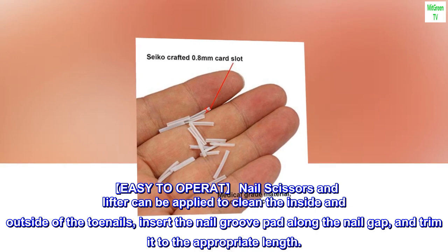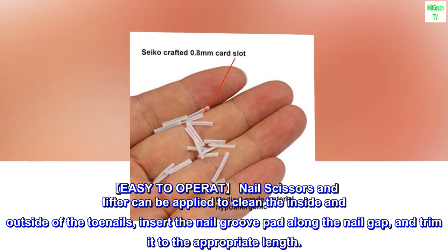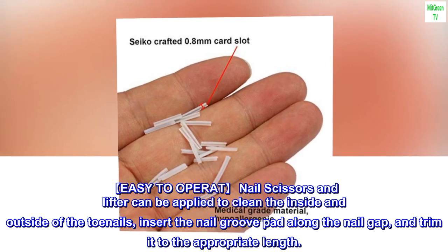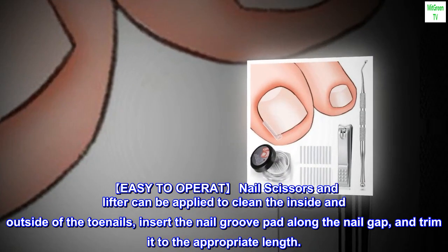Easy to operate. Nail scissors and lifter can be applied to clean the inside and outside of the toenails, insert the nail groove pad along the nail gap, and trim it to the appropriate length.